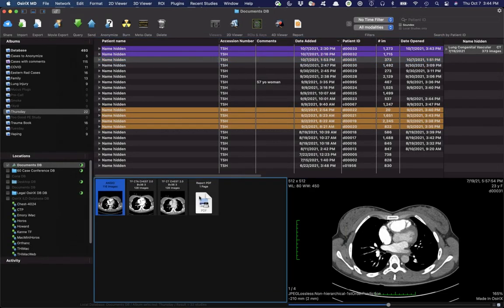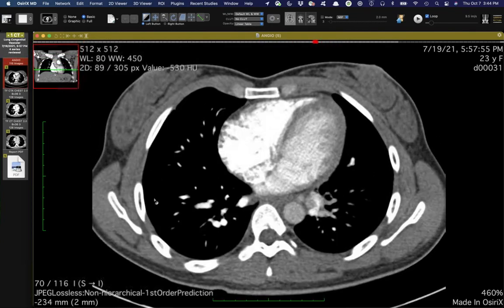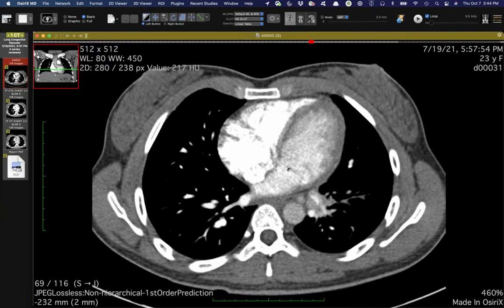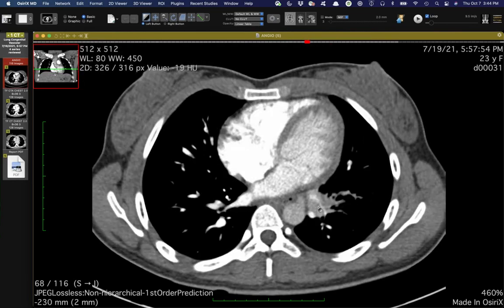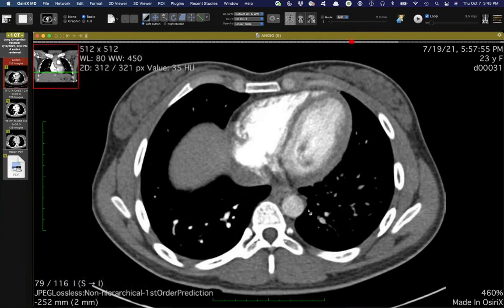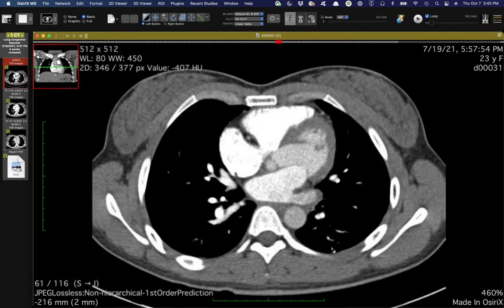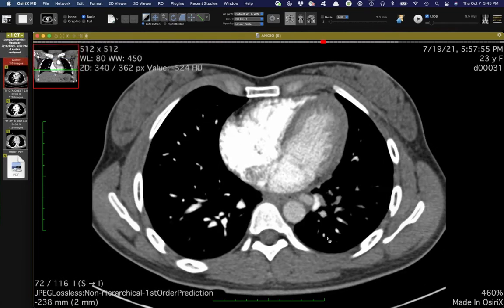This is one we've seen a couple of, and this was shown to me by a colleague, disappointed that the path didn't show what it was expected to show. This is a 23-year-old who presented with hemoptysis. This was the PE study, all done at the outside hospital. You can see a vessel arising from the aorta here, and we're still in a pulmonary artery phase. She's got pulmonary arteries elsewhere in the upper lobe, but not really in the left lower lobe.